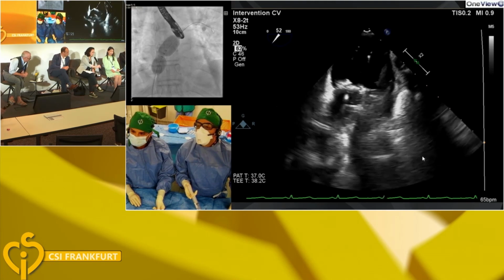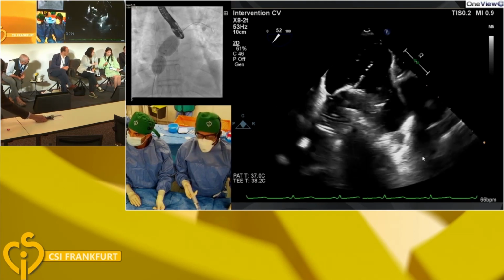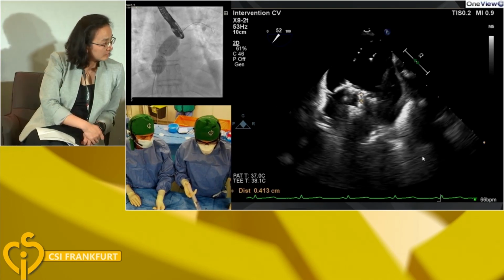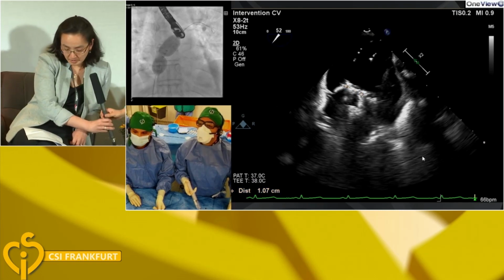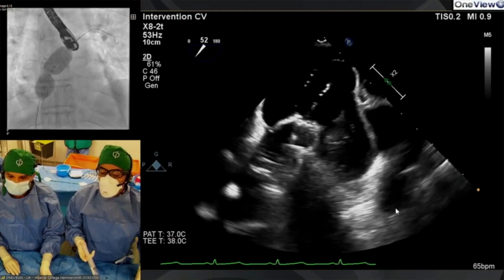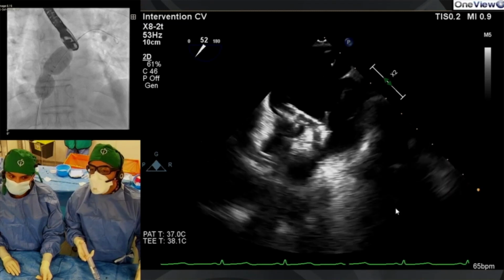Dr. Yoon, how do you in your practice with balloon sizing apply it? This kind of case, the morphology, I would do balloon, but then the interrogation we measure and then we will decide. So on the basis of that balloon appearance on there, what device are people now leaning toward?